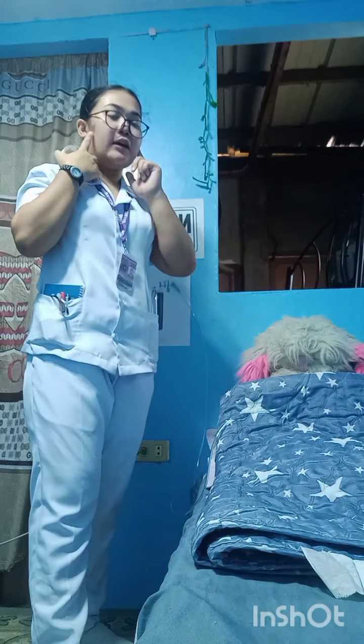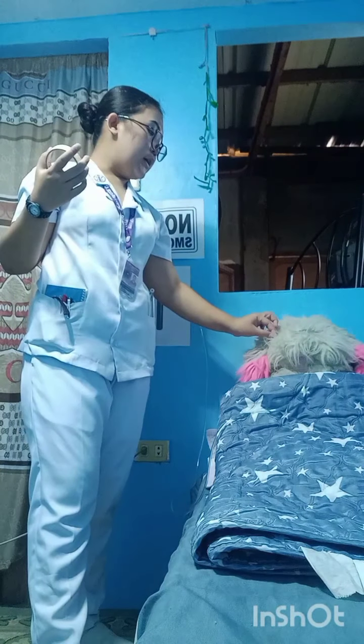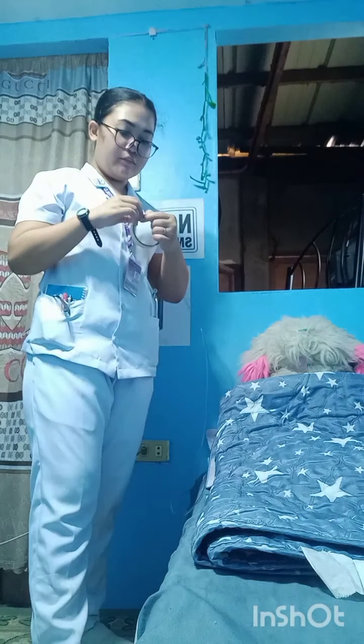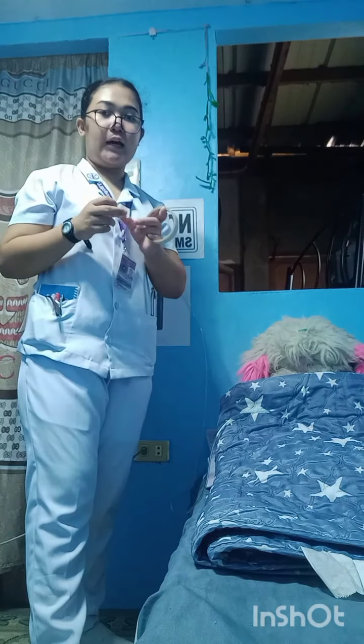Kasi didikit lang siya. But our patient now is a stuffed toy which is mag-move talaga siya kasi hindi siya didikit. So, pwede natin siyang lagyan ng tape. Mostly naman din, lalagyan natin ng tape, lalo na yung mga bata. Kasi malikot yung mga bata, kaya pwede natin lagyan ng tape.